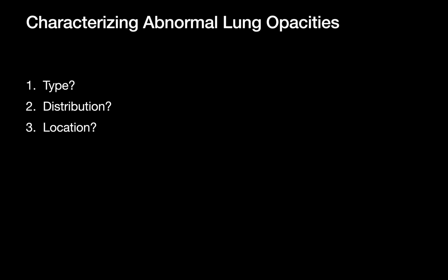Now, if there is an abnormal lung opacity, there's always going to be 3 questions I want you to answer. What is it? How is it distributed? And where is it? Type, distribution, location. Let's start with the first question.